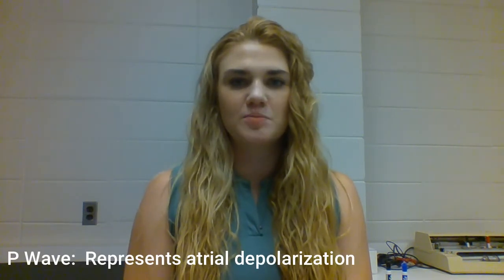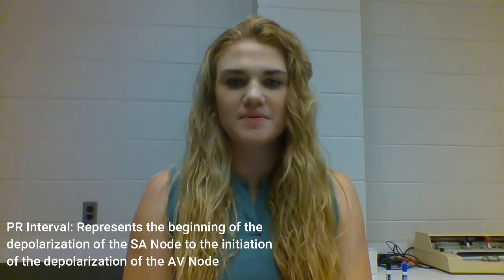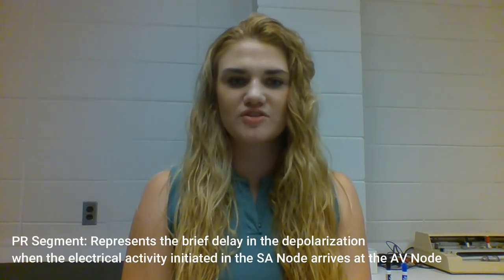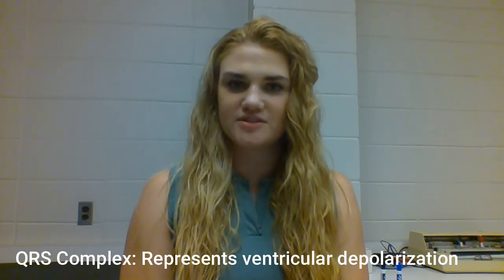Now that our subject has completed the procedure, let's examine the different components of the ECG tracing during a single cardiac cycle. An ECG tracing consists of segments, complexes, and intervals. The P wave represents atrial depolarization. The PR interval represents the ECG tracing from the beginning of depolarization of the SA node to the initiation of depolarization of the AV node. The PR segment represents a brief delay in the depolarization when the electrical activity initiated in the SA node arrives at the AV node. The QRS complex represents ventricle depolarization.